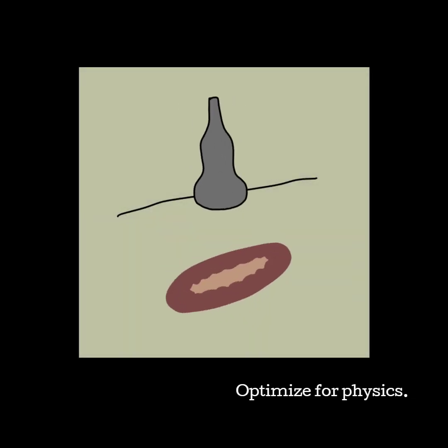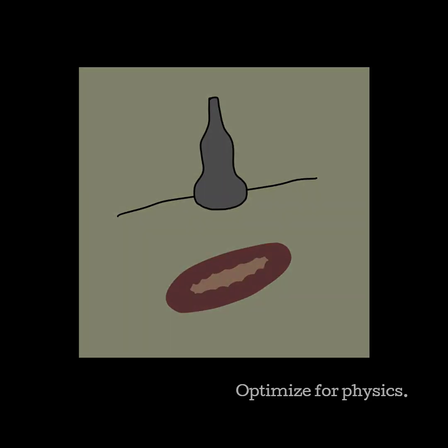The kidney is best imaged when it's horizontal on the screen. Try heel-toeing or rocking your transducer to achieve this. The pole of the kidney that is further away from the transducer is the side of the transducer that should be pushed further into the patient to level out the kidney. An angled kidney is not wrong, but you'll have superior sound penetration if you can bring the kidney into one plane.